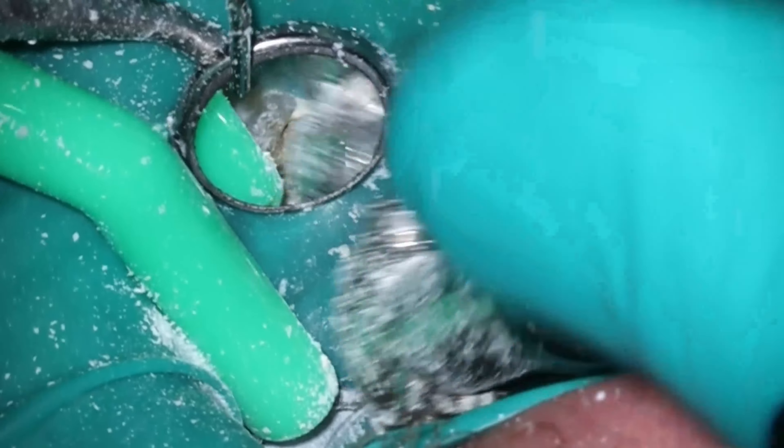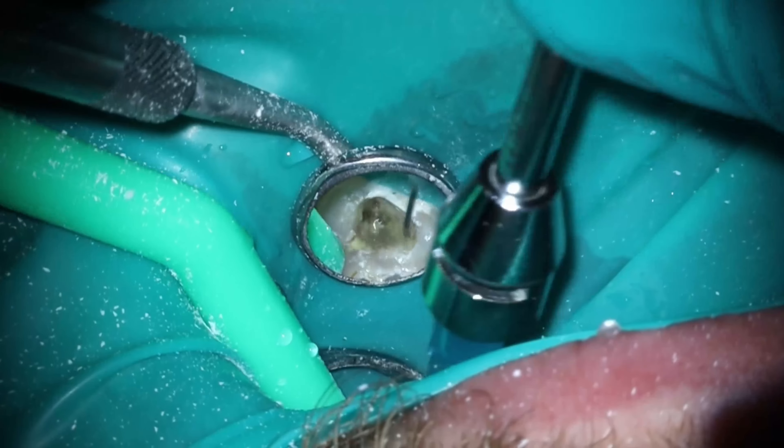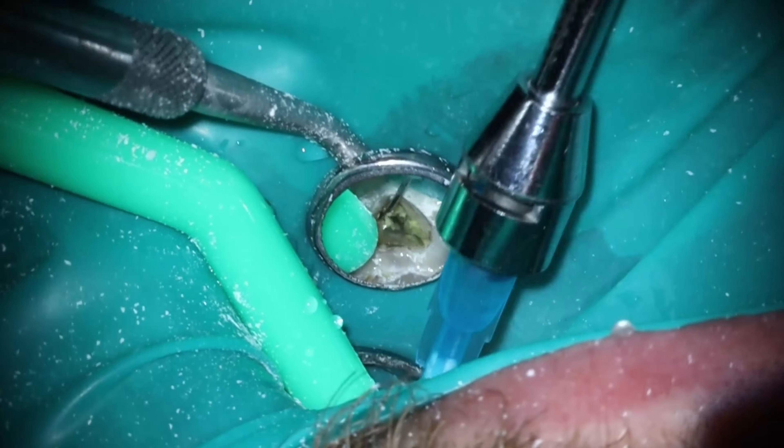First thing is, please don't use a cotton pellet. They're terrible. Use a sponge. You're going to have it anyway when you're using files. I've been harping on this one for a long time, but if you're still out there using cotton pellets, they're terrible to remove, and it's so much easier to use a sponge.